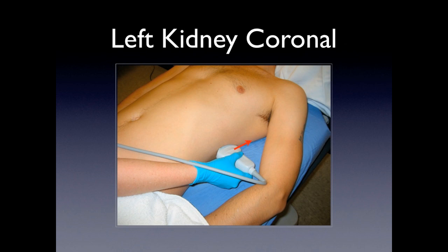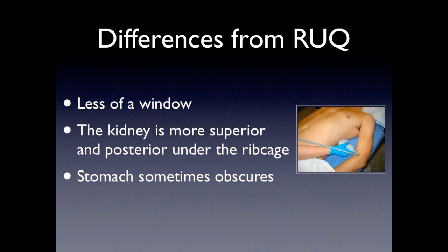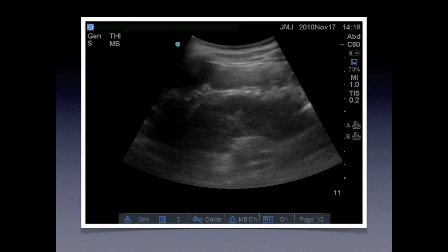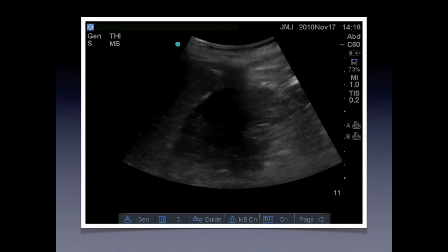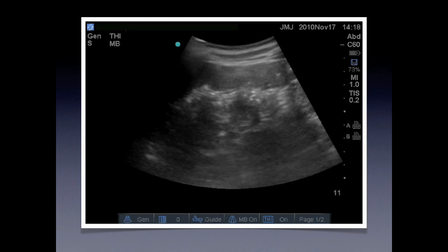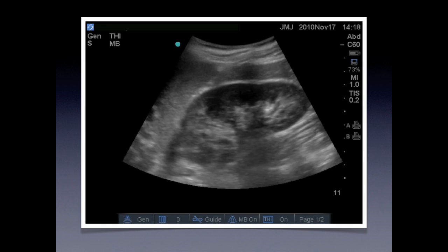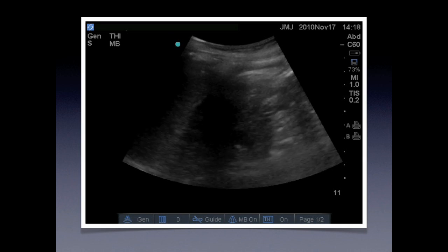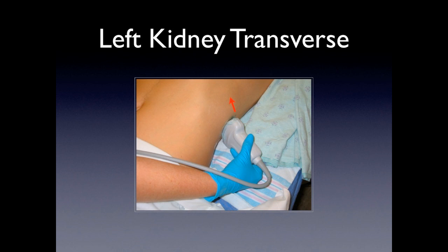Now let's switch sides. For the left kidney coronal view, the indicator is towards the head. The difference here is that you have less of a window because the kidney is more superior and hiding behind the ribcage, and sometimes the stomach may obscure the view. You should see the spleen on the left side of your screen and the kidney.